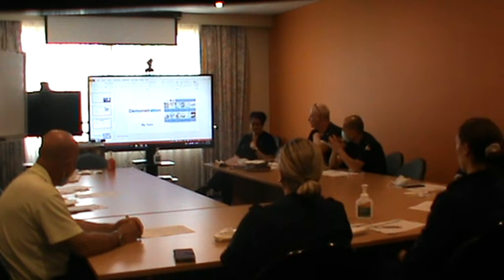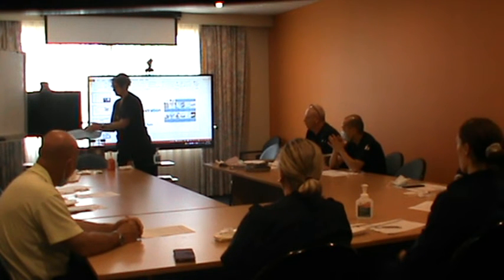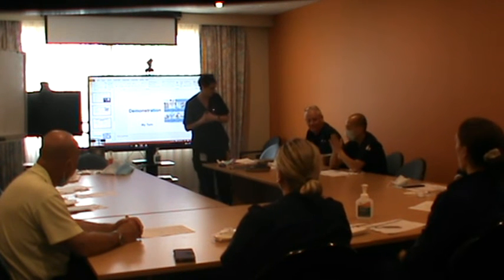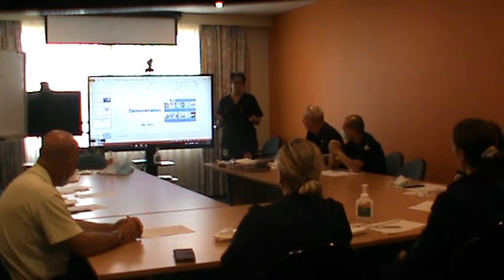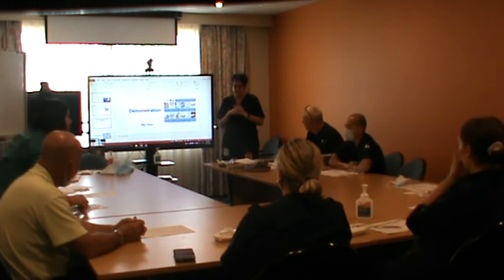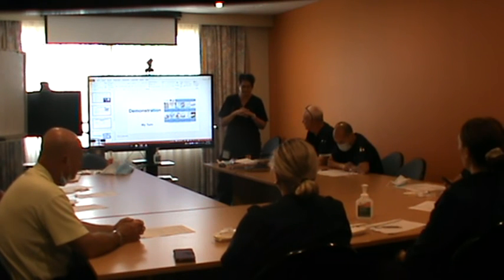Right, so it's my turn to set up the trolley for our cannulation. I'm just going to give those ones back to you. I'm going to clean off Karen's mess for a second. I've worked out my risk assessment, and I'm going to use an aseptic field because I'm going to put a cannula in. I don't want to give the person a bug. So, do I require it? This patient needs antibiotics because they've got pneumonia, so yeah, they probably do need a cannula.